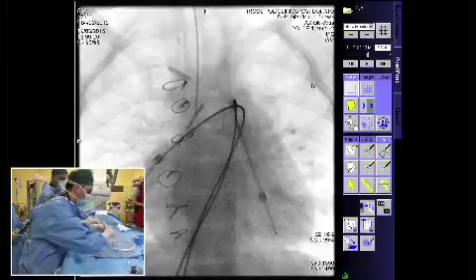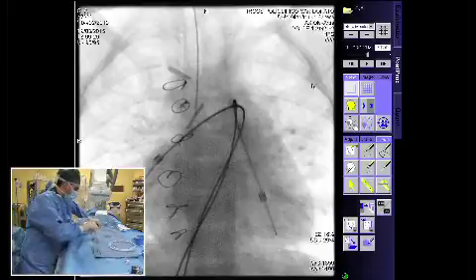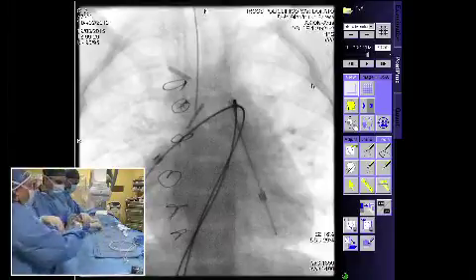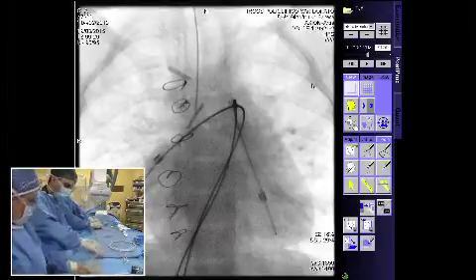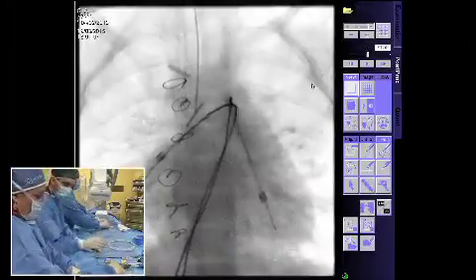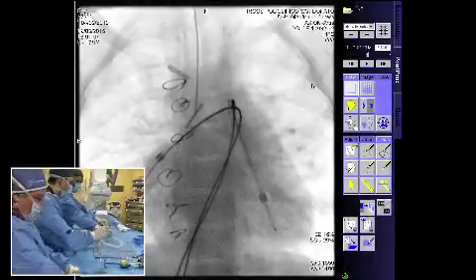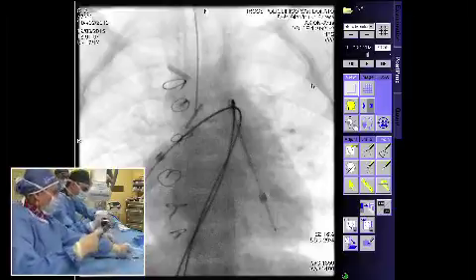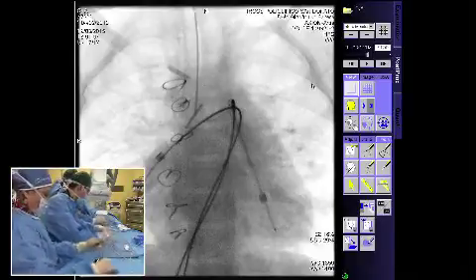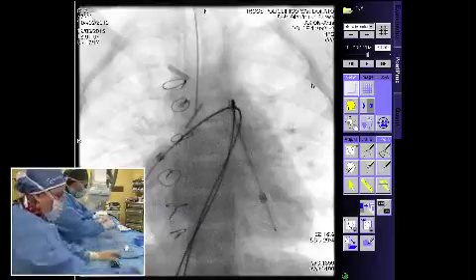There was a paper describing breakage of a Valeo stent implanted in the superior vena cava of an adult, so this is why FDA gave some alerts about the use of these stents, but actually we had no such kind of experience in kids. And the smallest kid we have treated has been a 2.8 kilogram baby where we implanted 2 Valeo stents in bilateral stenosis of pulmonary arteries after truncus arteriosus surgical treatment.